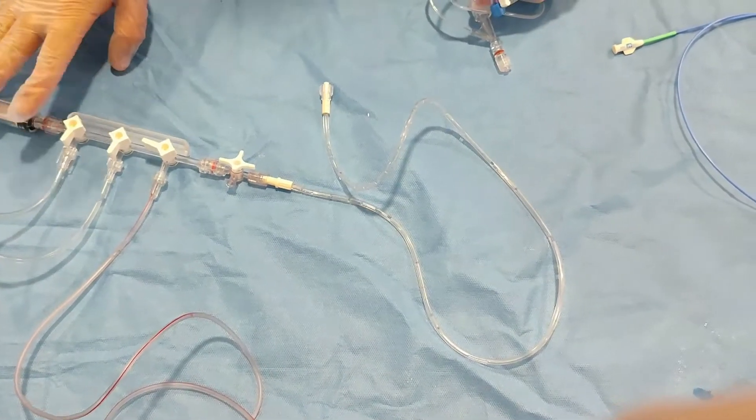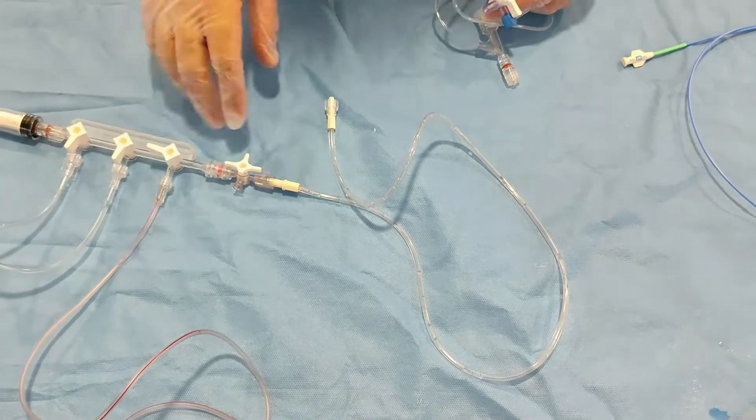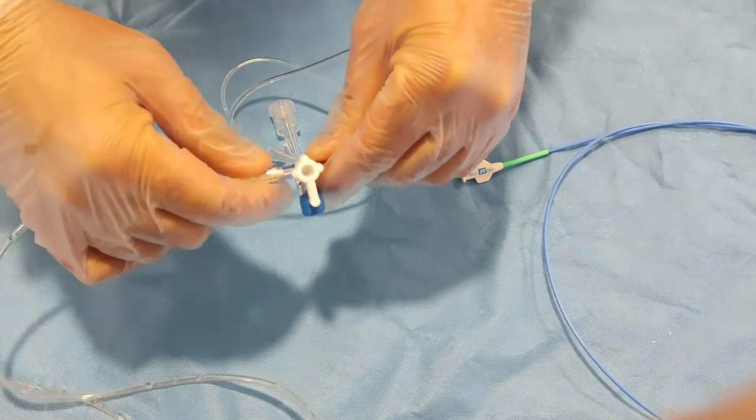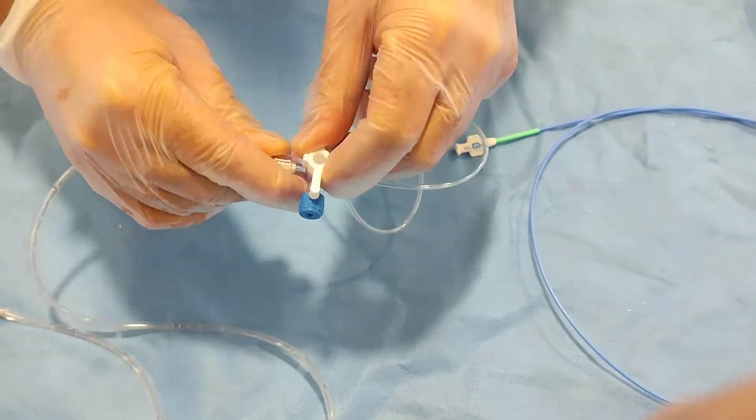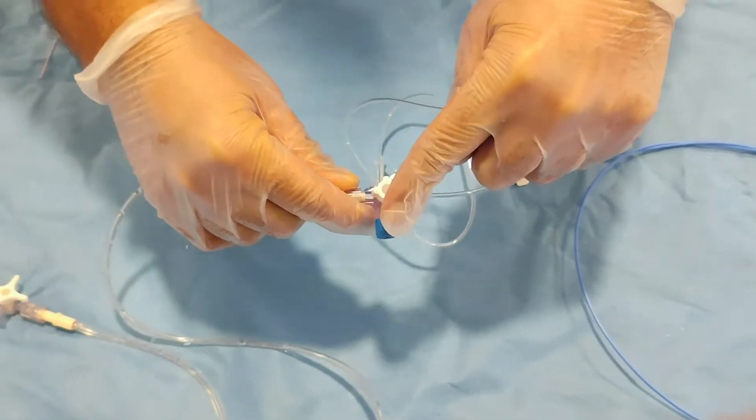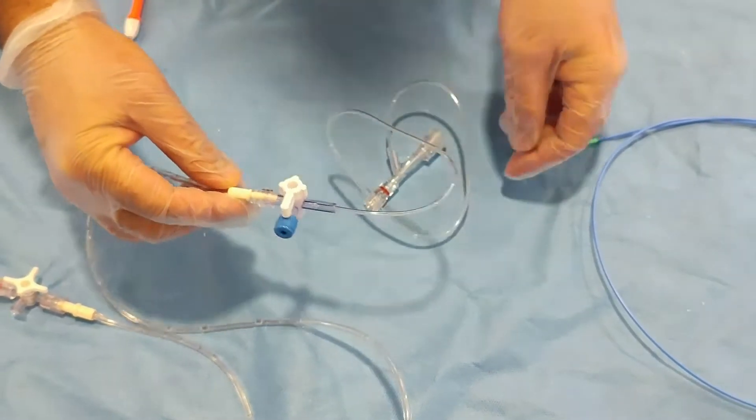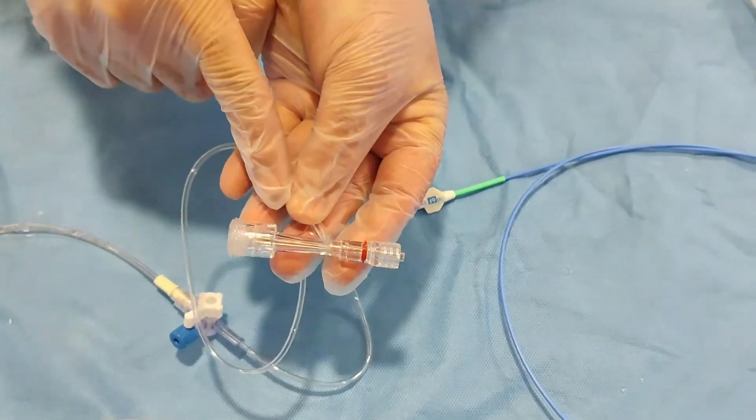So how to make it ready? This is the manifold which you have already made ready. Just take this connection, attach it here. This port, as I mentioned in the last video, this side is closed, so make it open to the operator side and the patient side.